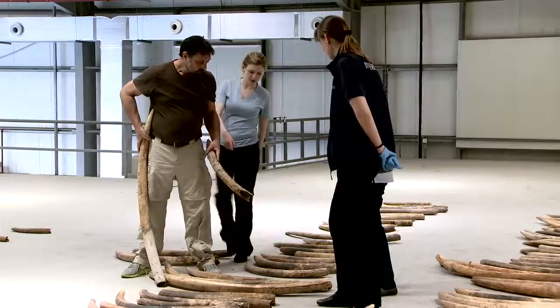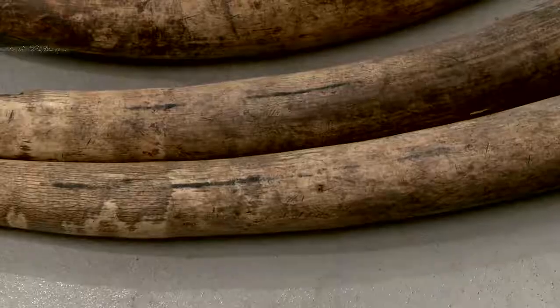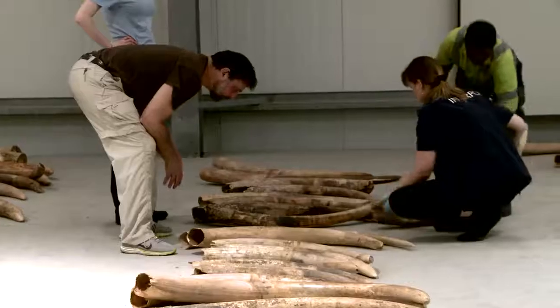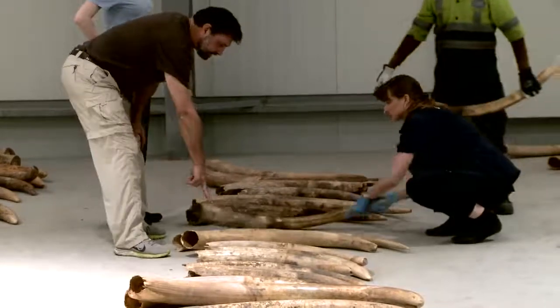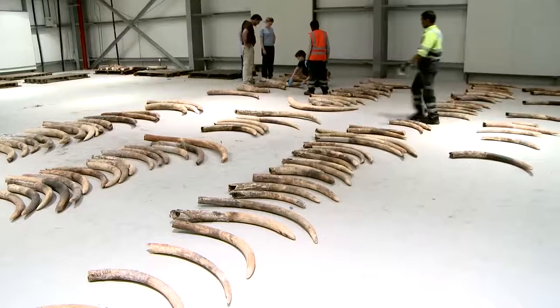Rearrange neighbouring tusks so that as many as possible are matched according to these criteria: similar size, colour, gum line. When finished, remove every second tusk. These tusks will not be sampled. You will now be left with half the tusks.